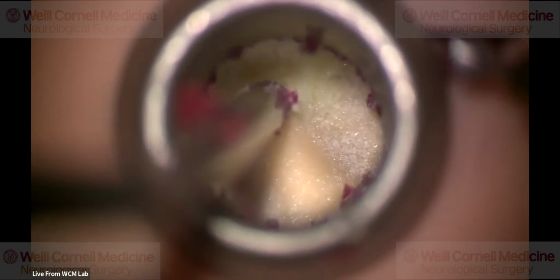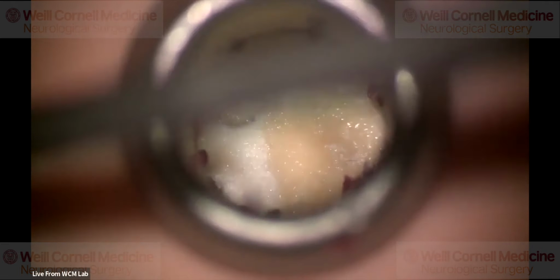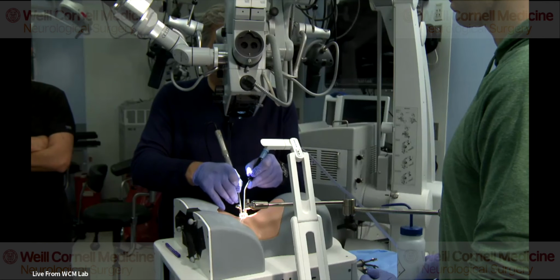And I start drilling, typically at the inferior edge of the cranial lamina. So I thin this down because I want to find the insertion of the ligament, more or less, and the lateral aspect of the dura. You can see how I always rest the drill on the edge of the tube, which helps you to be steady.